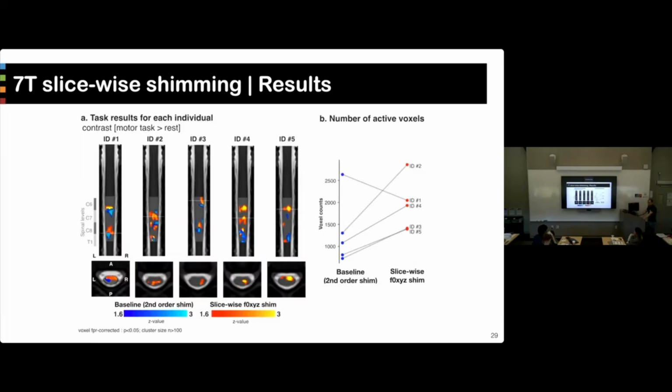So we didn't do that just for TSNR measurements. We did that in fMRI tasks. What we were doing is we had the patient do a motor test. They had a squeeze ball in their hand. They were all right-handed, and they were squeezing the ball for 20 seconds, and then after 20 seconds, release it for another 20 seconds, and then they repeated that for, I think, 10 times.